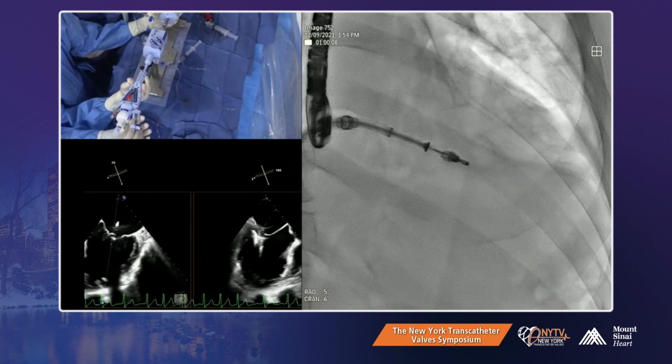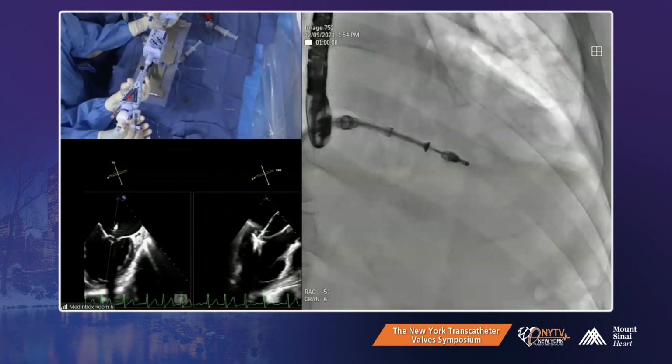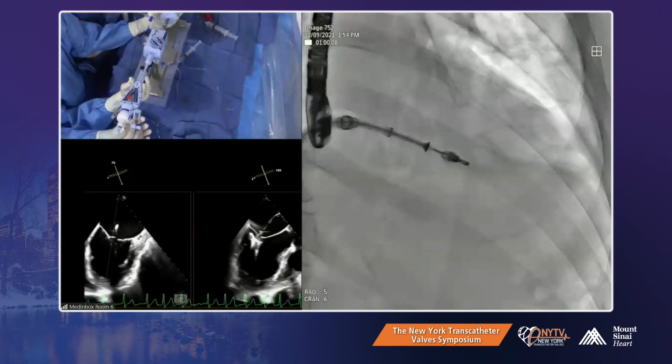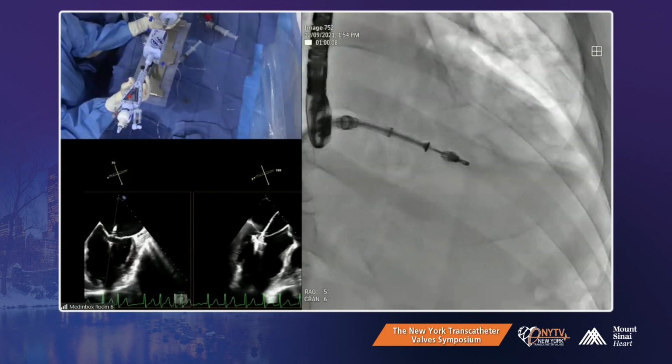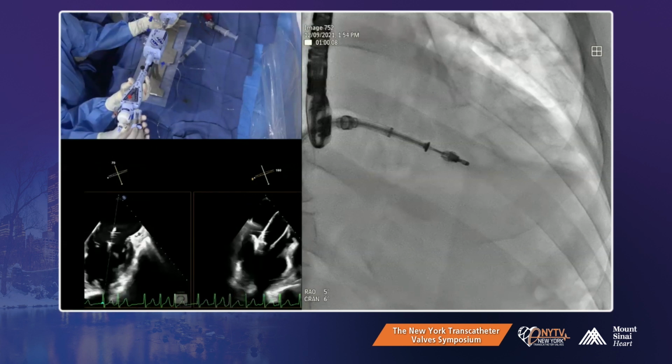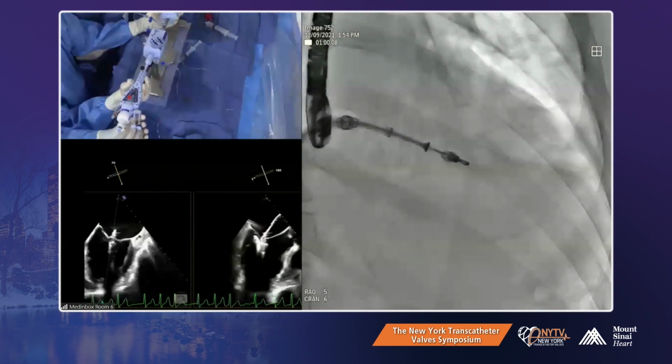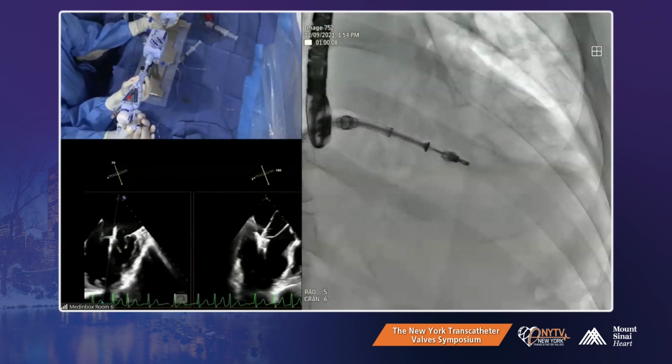Posterior. It actually looks like the heart rate's a little bit slower, Gilbert. What is it? Is it still around 70? It's about 100, maybe 95. Okay, try now. You're on a fast sweep then. Anterior is going. Anterior buckling?